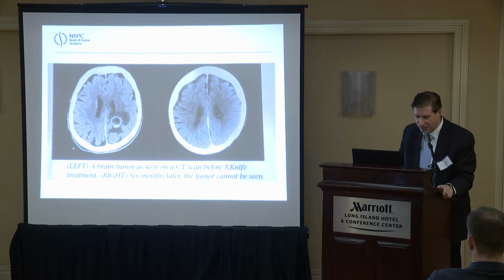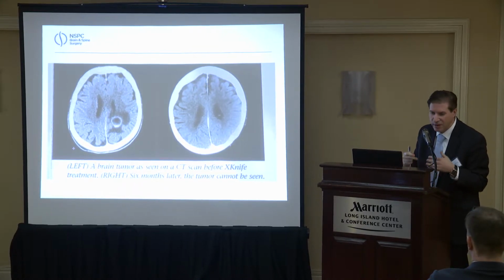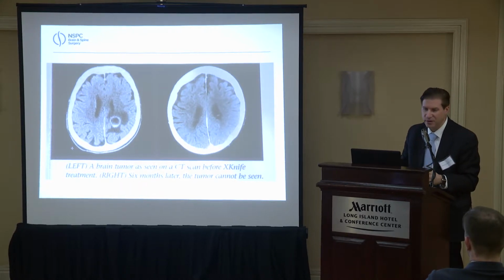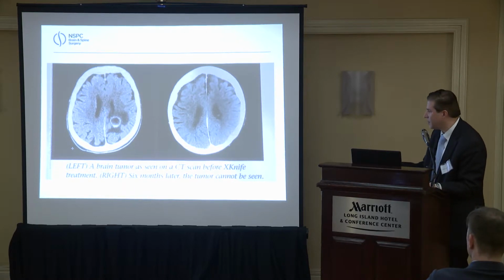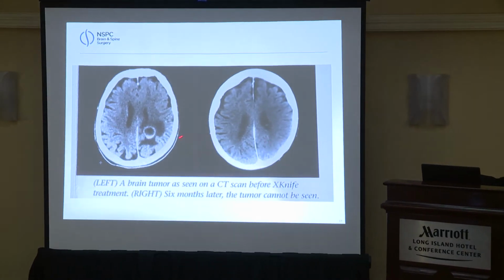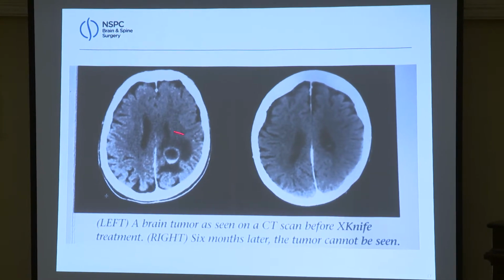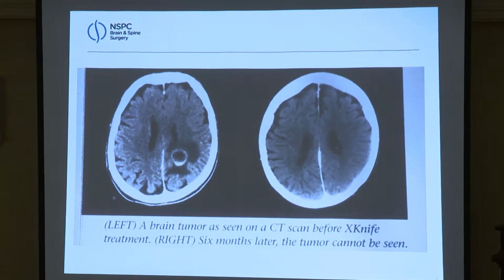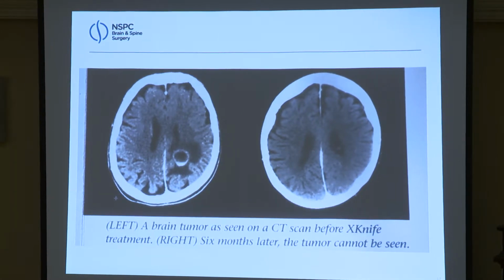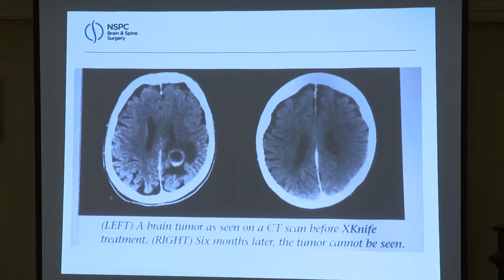I think a lot of people agree with that, and data bears out the benefits, maybe not for 50 brain metastases, but we're doing up to 10, and you can do them even in a single session with Gamma Knife. This is an example of a treatment before and after with an X-Knife, one of the earlier systems. And again, this is months later, you see the thing is totally gone. One thought is, well, if there's edema, is that a problem? But we can put people on steroids, and the edema does not preclude us from doing treatment and getting a very good result.